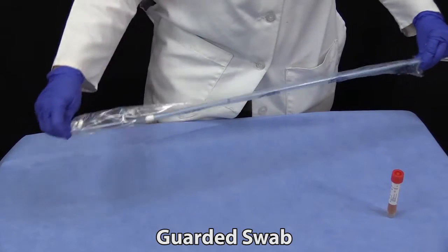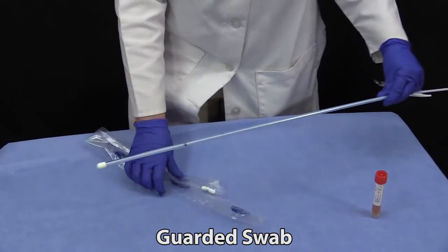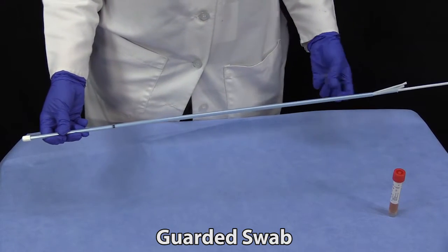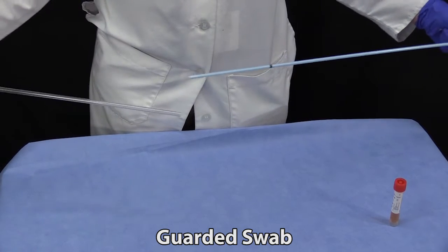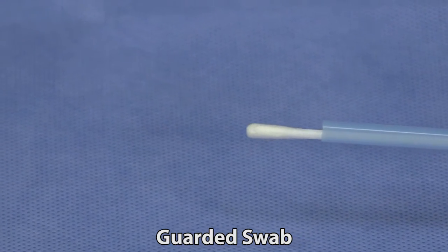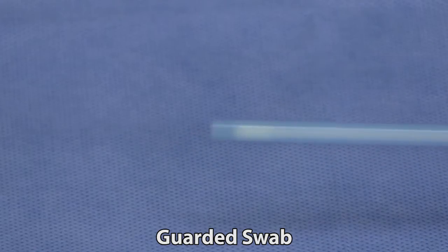Guarded swabs are useful for sampling areas that must be accessed through an area that contains a lot of normal flora. Examples include pre-breeding culture of a mare's uterus and deep nasopharyngeal swabs in cases of bovine respiratory disease. After the unit has been passed to the area you want to sample, the swab is extended out of the guard and the sample collected. The swab is then drawn back into the guard and the entire unit withdrawn.